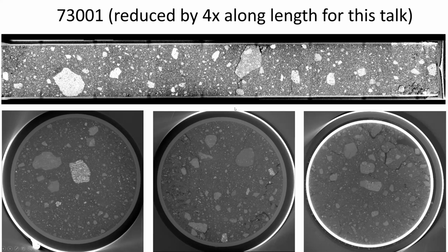So on the bottom of the core, this part is bright and this one is dark. And then when we go to the very bottom of the core here, there's actually a stainless steel cap over the end that was used for drilling into the moon, which brightens up everything. So we had to go and figure out how to fix all these things.